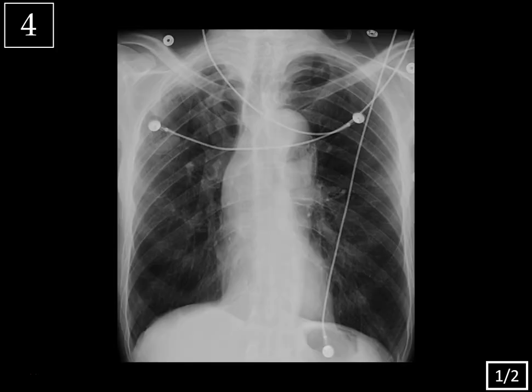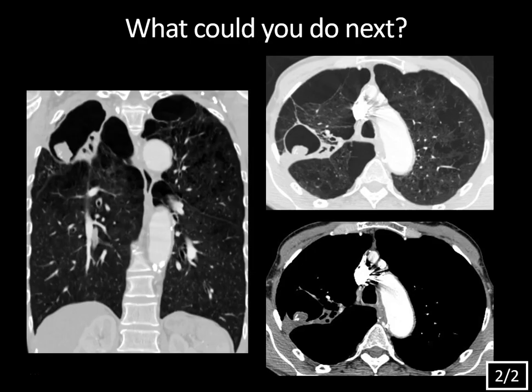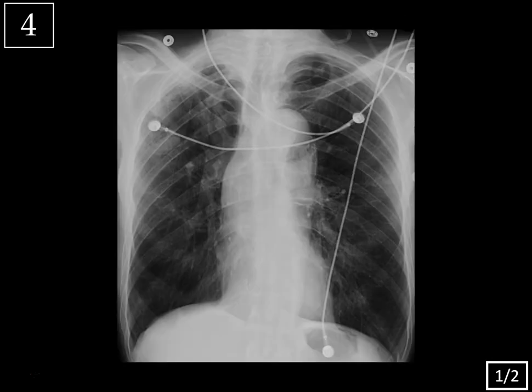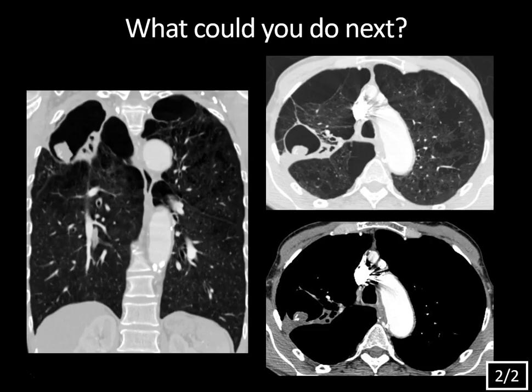Case 4, chest X-ray and CT chest — what could you do next to confirm the diagnosis? On the chest X-ray, there is a faint nodular density at the right lung apex. There's also hyperinflation with emphysematous changes. On the coronal reformatted CT chest, that nodular density is actually within a large cavity at the right lung apex, and we have bilateral apical bullae. On axial CT with lung windows, the cavity is thin-walled with that nodular density within it.